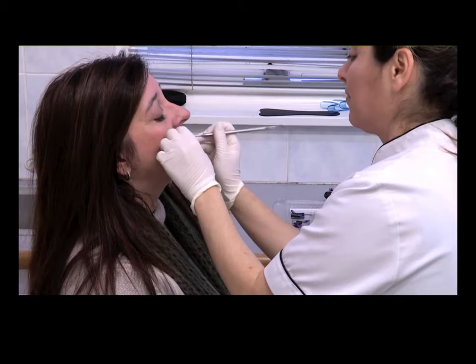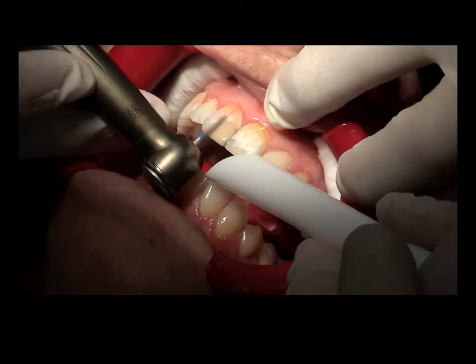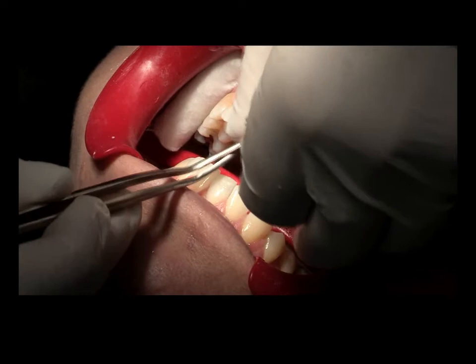I'm going to show you a case of 2 central incisors that was done in 25 minutes with Uveneer. First, I always do a mock-up. I sit the patient and we choose the right shade. I try many brands until I find the exact shade that will match. Minimally prep, apply the separation between the teeth, and just do one tooth at a time.